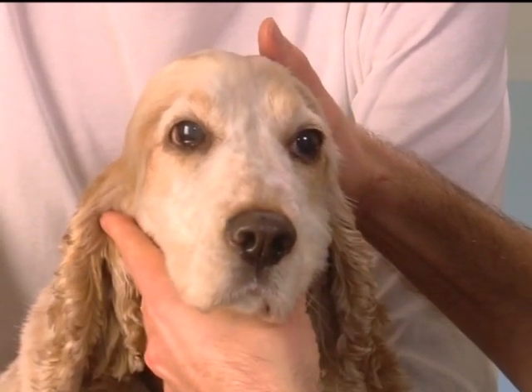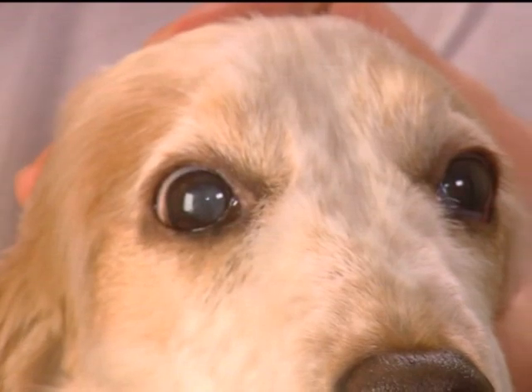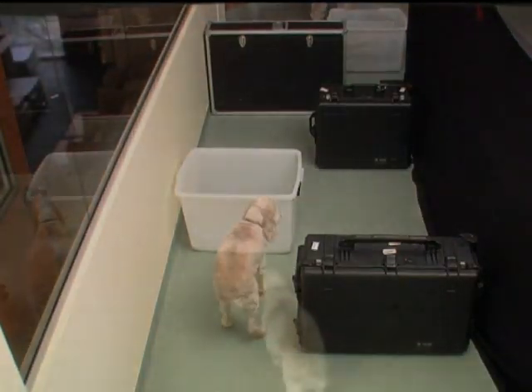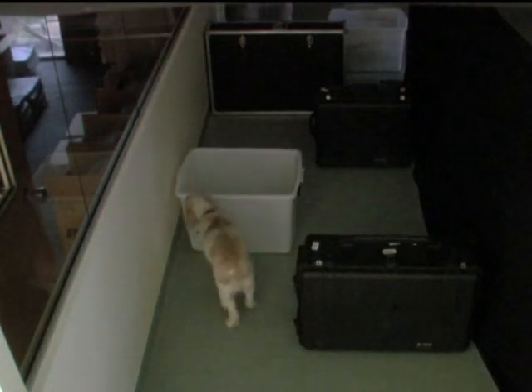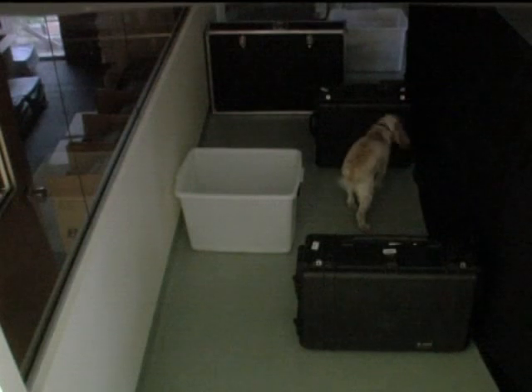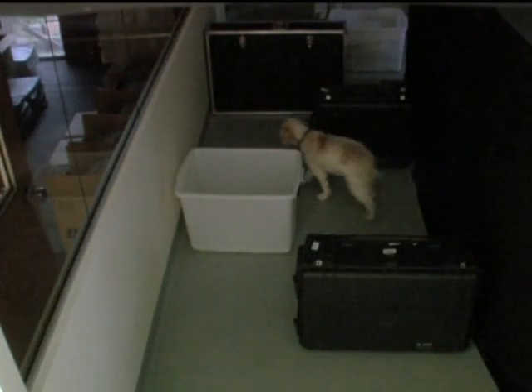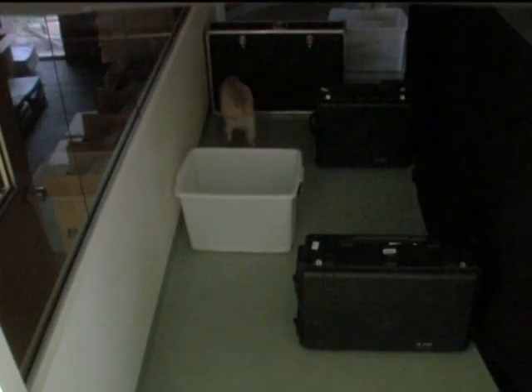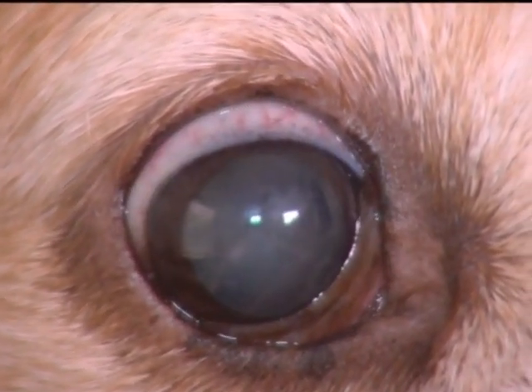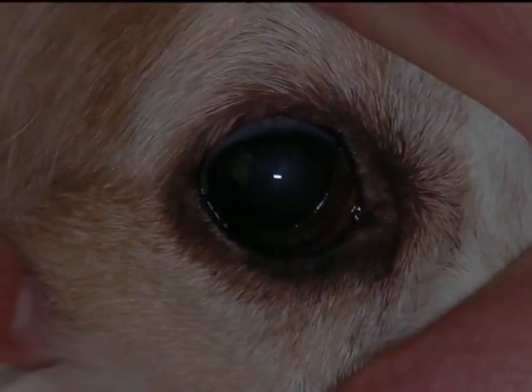This 7-year-old Cocker Spaniel presented with poor vision and cloudy eyes. The maze test established that vision was worse in dim light. This raised suspicion of progressive retinal atrophy, or PRA, particularly as this is recognised as an inherited disease in this breed. The dog's pupils were dilated under normal light, and the pupillary light reflex was present but incomplete.